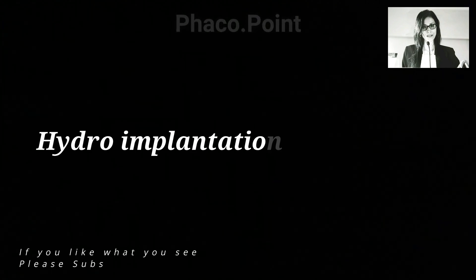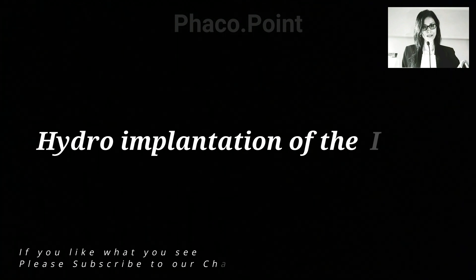The following video will depict the technique of hydro implantation of an IOL in the capsular bag — that is, the implantation of the IOL under Ringer's lactate solution itself without the use of viscoelastic. This is a technique I would currently prefer because it negates the need to introduce viscoelastic for IOL insertion, and more importantly eliminates the time and fluid entry into the eye required to actually remove the viscoelastic.